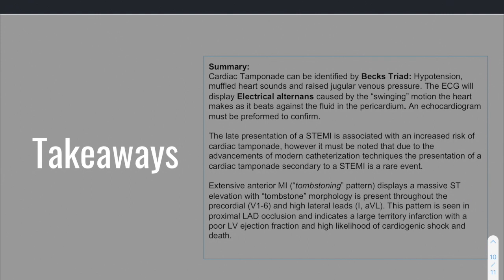And of course, again, in addition to your ECG, your history and your exam are going to be really crucial in identifying this particular pathology.